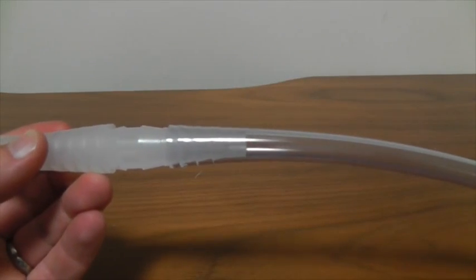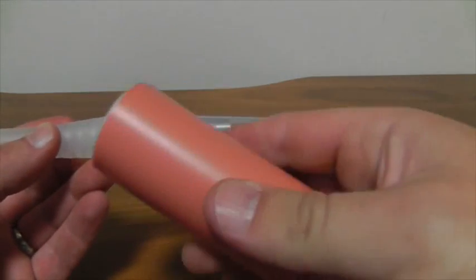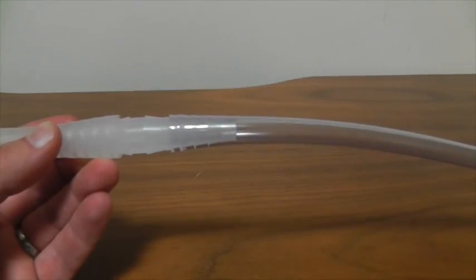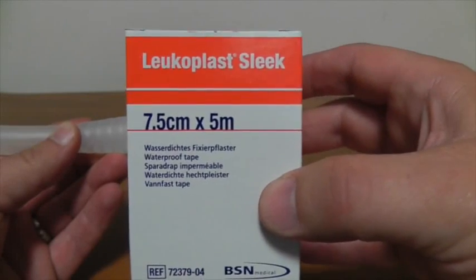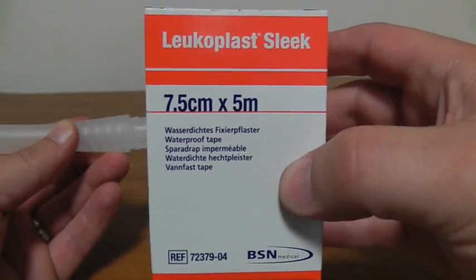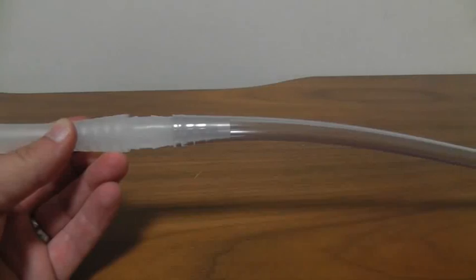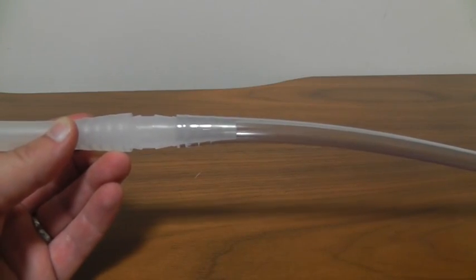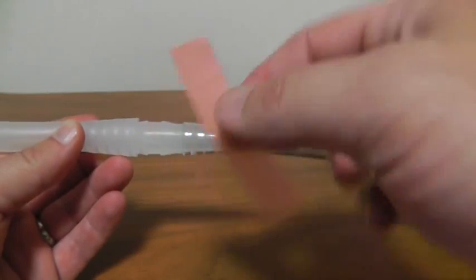What you're going to need next is four pieces of Sleek. So this is Sleek plasticky orange tape. This is what the box looks like if you haven't ordered it before. Leukoplast Sleek. I'm not fussed about which brand you use, but the 7.5cm is a good width to use. You're going to need four pieces that are about a centimeter wide, 7.5cm long.